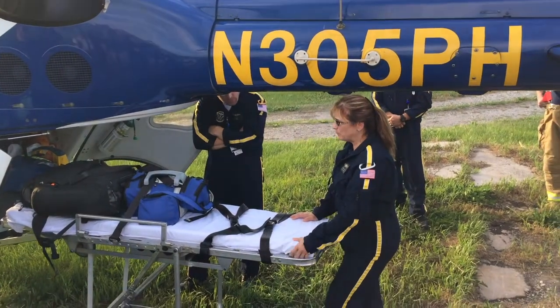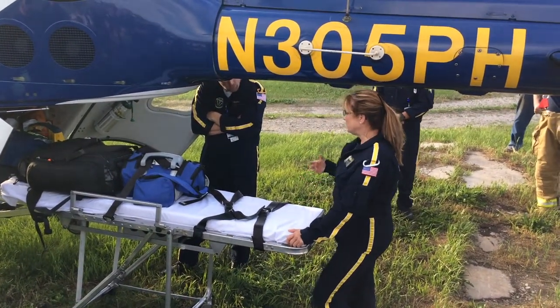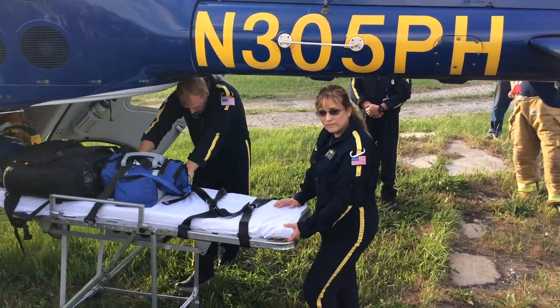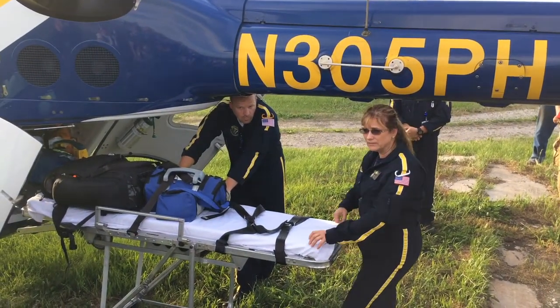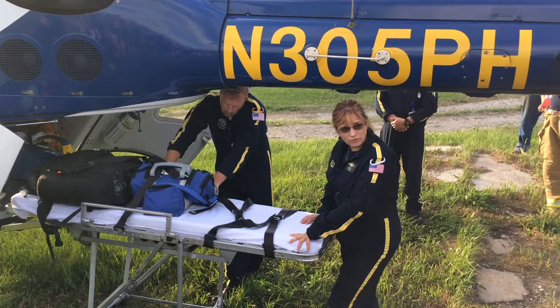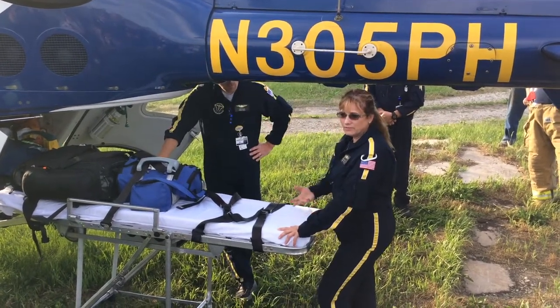The weight we can take on this helicopter varies depending on the crew, the equipment size, and how much fuel we have on board. If you let us know a patient weight beforehand, we can pre-plan and adjust. Sometimes we can run a bit and burn off some fuel to accommodate a larger patient. But we are still limited by the 400-pound cot restriction.